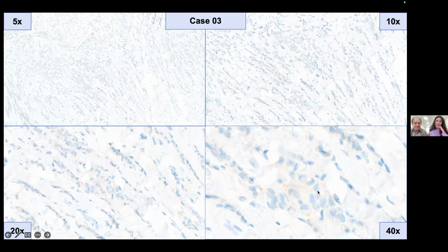It's 1+. Okay, so let's keep a few more people voting. Okay, shall I stop and poll? If you share the results, these are the results. Most people thought this was ultra low. Some people thought it was null, no staining whatsoever, and some people 1+.